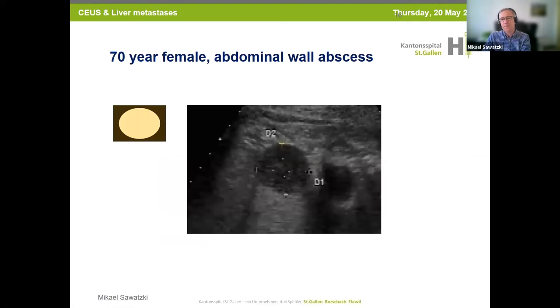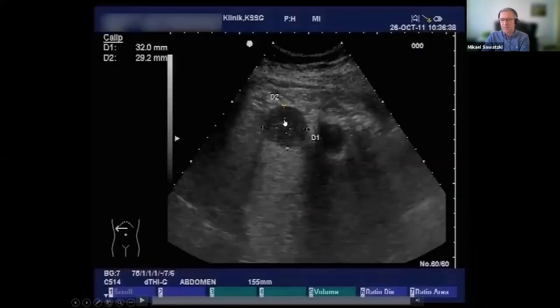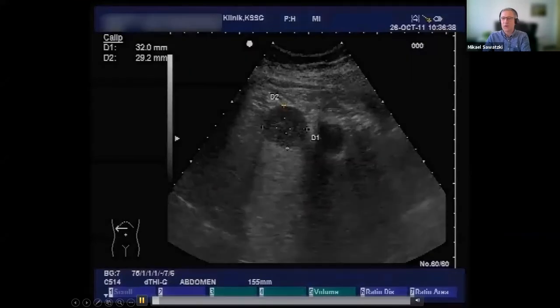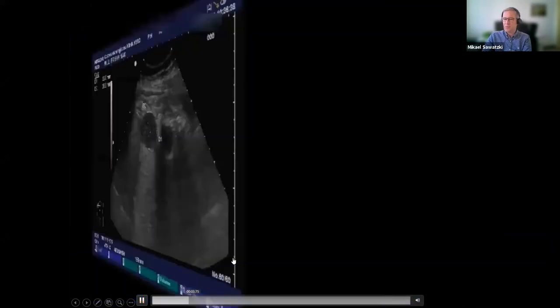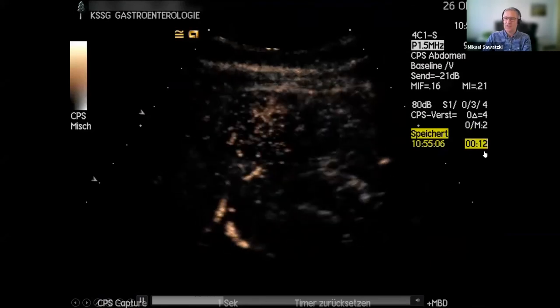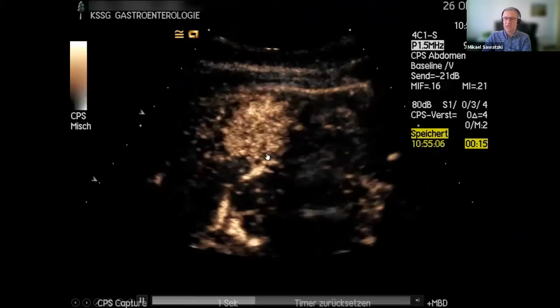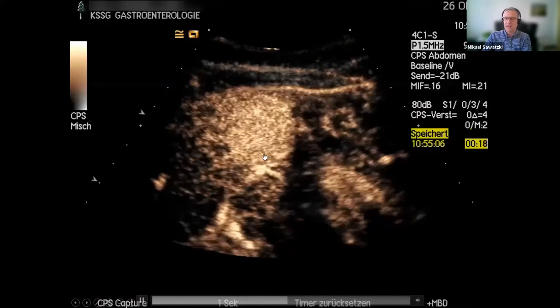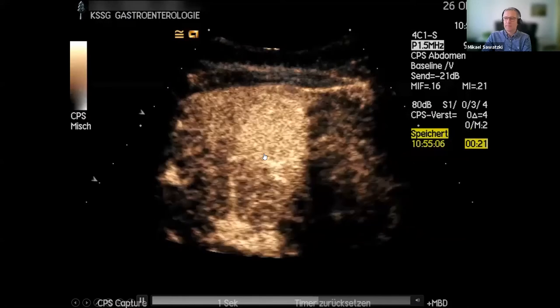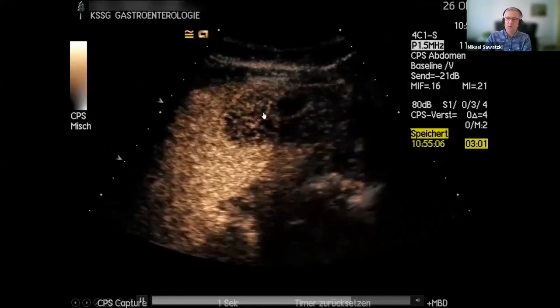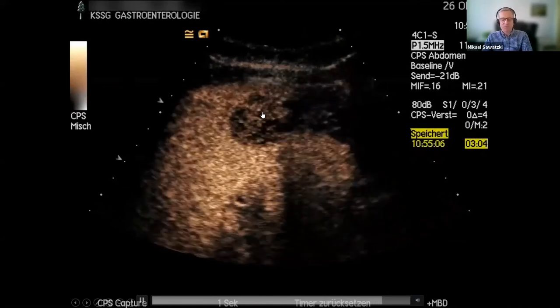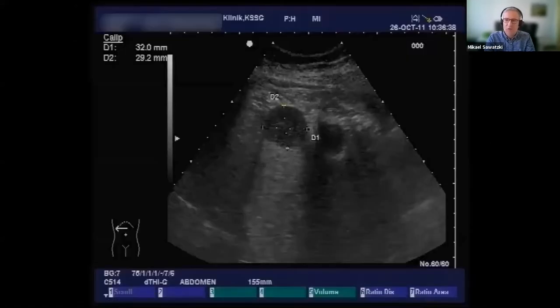This is an example of a hyper-enhanced liver metastasis. A 70-year-old female patient with an abdominal wall abscess: you see a cystic lesion with echogenic material inside — you are not sure if it is a cyst or an abscess. After performing contrast-enhanced ultrasound, seconds after IV injection of SonoVue, you can answer: it is not a cyst, it is not an abscess — there is hyper-enhancement of this lesion. Then after 3 minutes you see washout, confirming a malignant liver lesion. Biopsy proved a primary B-cell lymphoma of the liver.